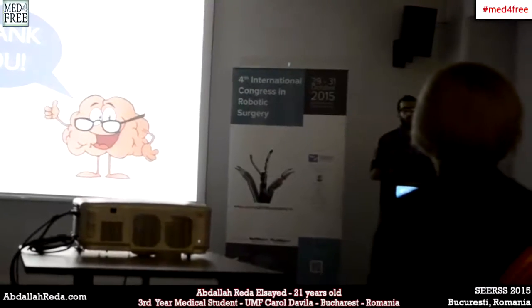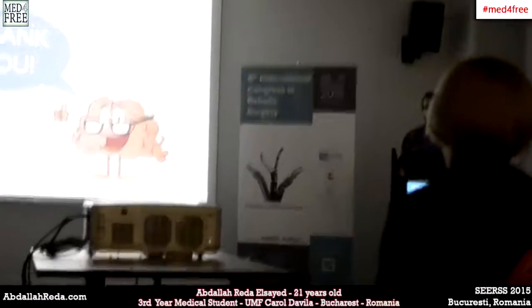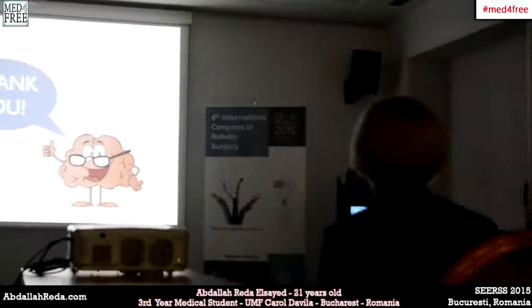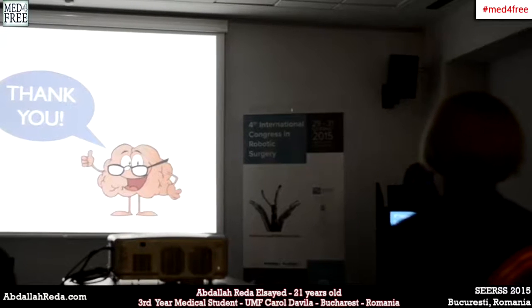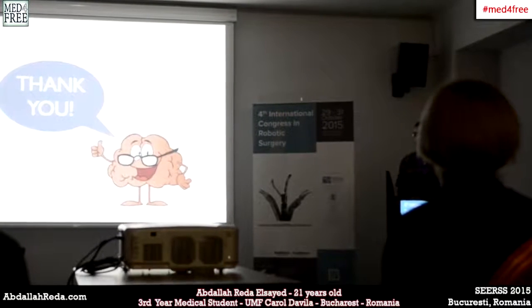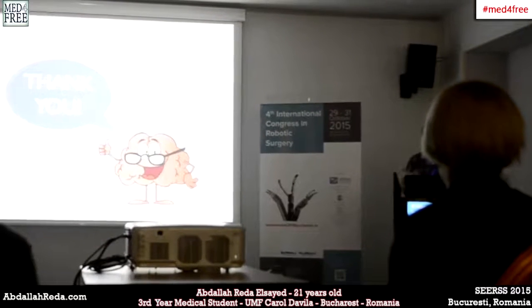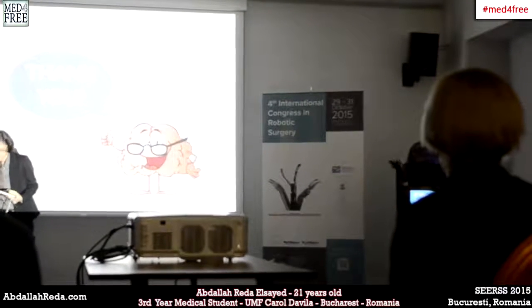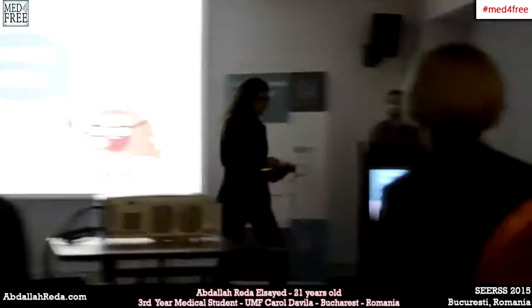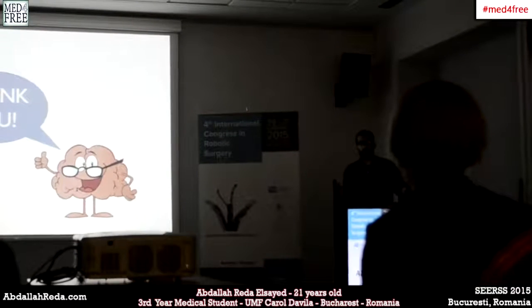Assuming you want to become a neurosurgeon, which one of these robotic systems you presented would you choose to perform a robotic neurosurgery? I would choose the Da Vinci. Because currently that's the one that is very compatible with a surgeon. You work very relaxed, you have plenty of space to work with. You have 4 arms, each with 7 degrees of freedom, which is pretty good. That new one with 2 arms and 13 degrees of freedom, I don't know how that would work out. But till then, I would choose Da Vinci, I guess. Okay, thank you.